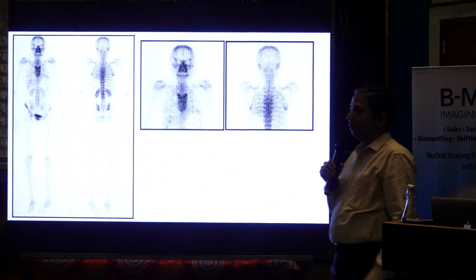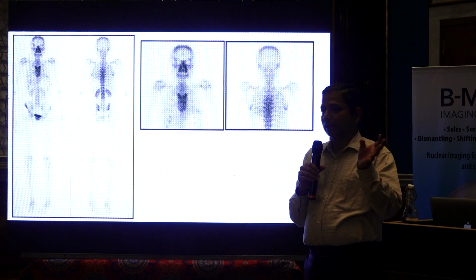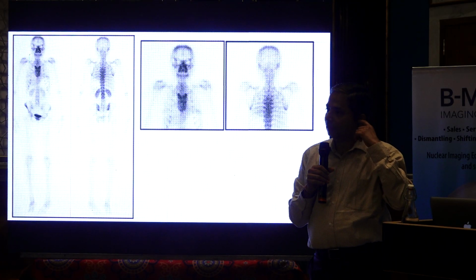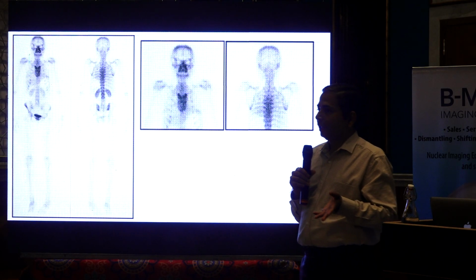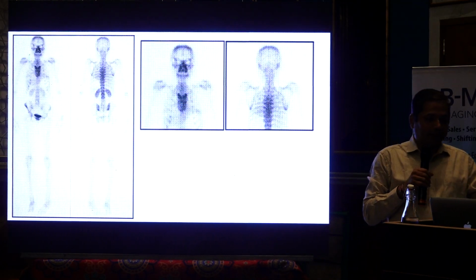It's a lady who presented with chest pain. She had gone to multiple doctors, but was not diagnosed. They were giving medicines, NSAIDs. When she takes them, the pain is relieved, but again it comes back. They did radiographs, which were normal. They couldn't pick up anything in that.